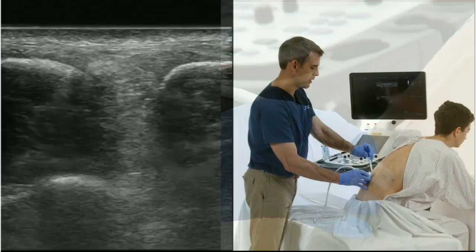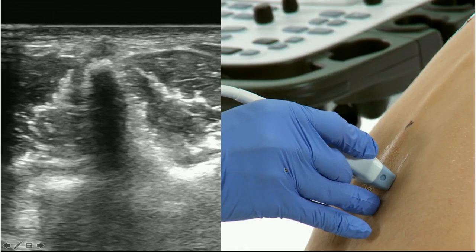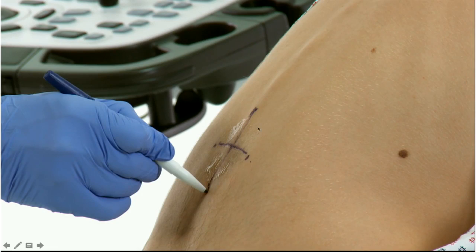Go back 1 slide for me, Martin. Yeah, sure. Here you have a sagittal cut, so it's hard to see, but the operator is marking the skin, basically where the spinal column is in the sagittal plane. And then the next slide, you can see that the transducer will be turned, and now you have an axial plane, and you'll go ahead and mark the skin again. And then the next move is simply to go ahead and connect those two lines, and essentially X marks the spot where you're going to put the needle. Go ahead and advance that slide for me. There you go. Now you have an X marks the spot, and now you would basically put your ultrasound away and go ahead and start the procedure.